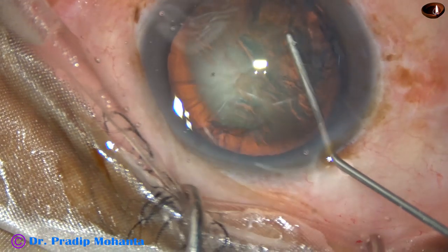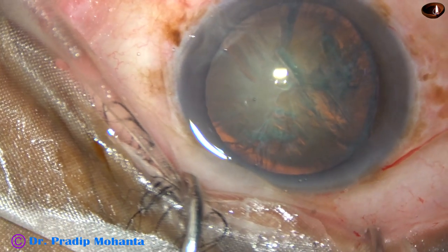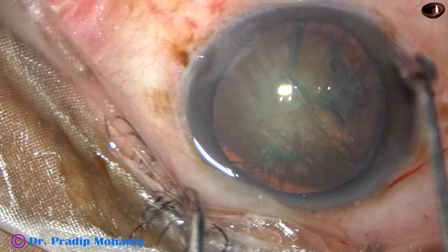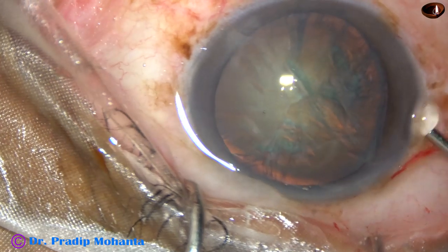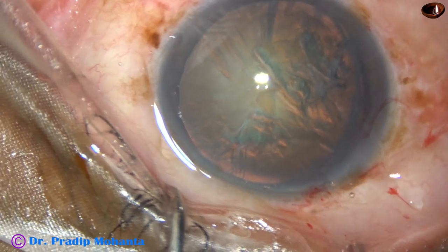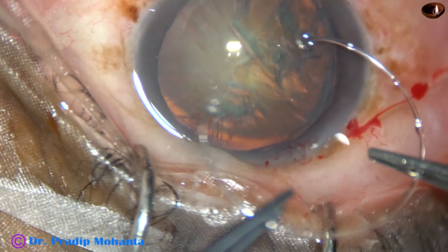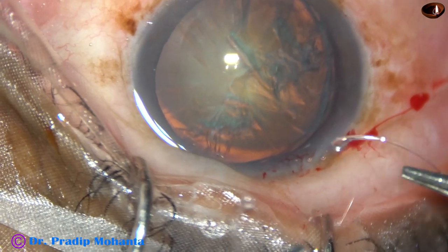Yes, by this time nice hydrodissection has occurred. But I don't want to rotate the nucleus with one hand — I want to rotate it bimanually after placing the CTR. Now, here goes the CTR, the capsular tension ring.